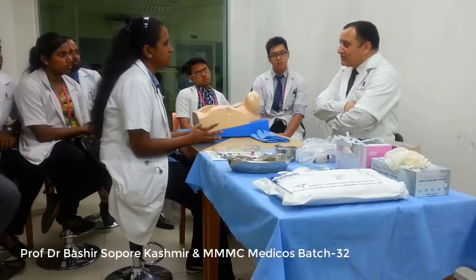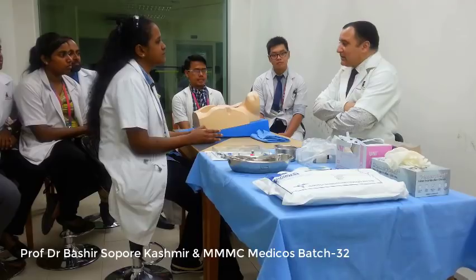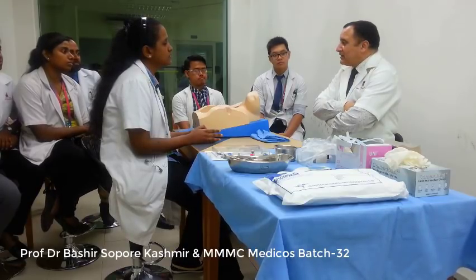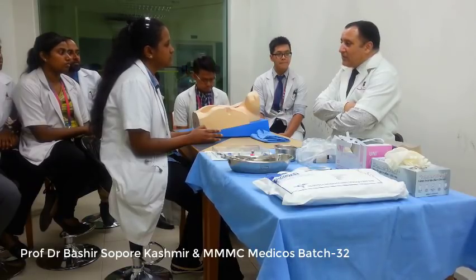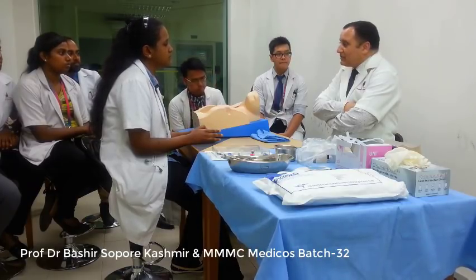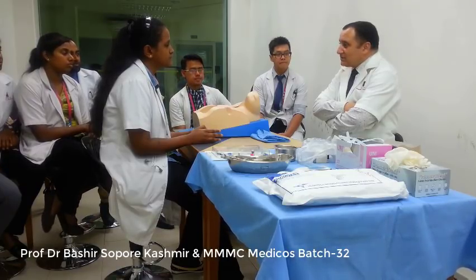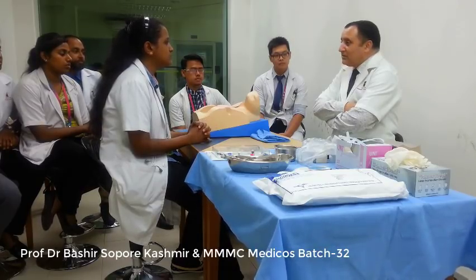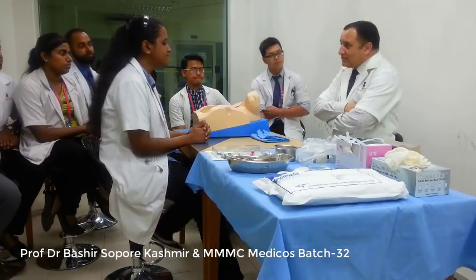The other indications are whenever a person is in cardiac shock, or has severe hypotension. At that time there will be inability to obtain peripheral vein access. The peripheral veins in these conditions will be collapsed, and it will be very difficult to access them, so we resort to central venous catheterization in such cases.